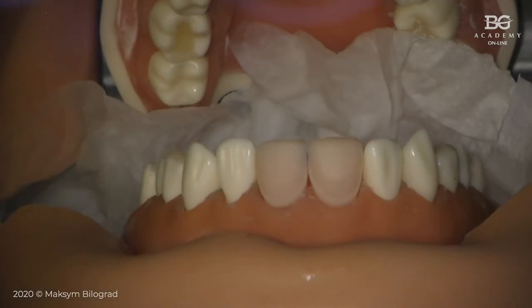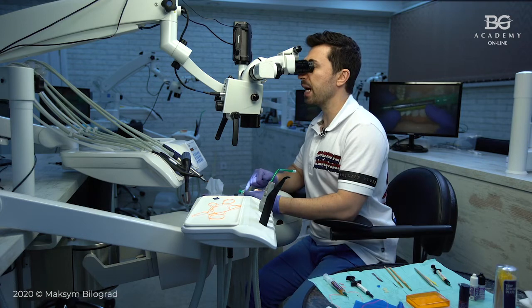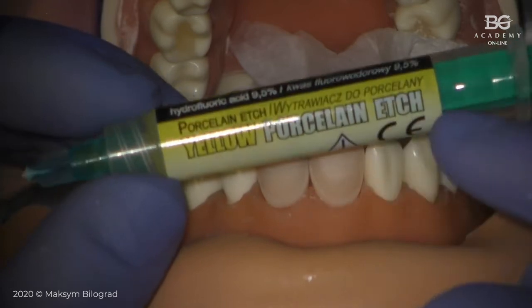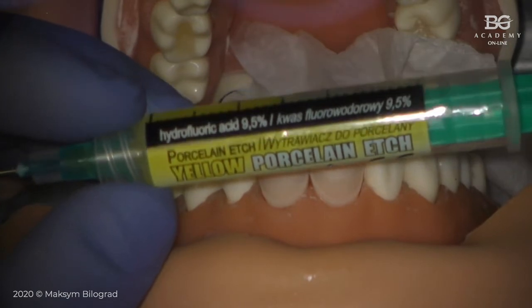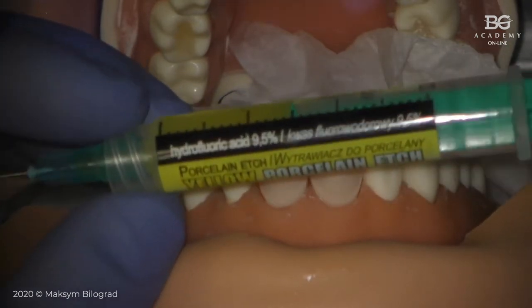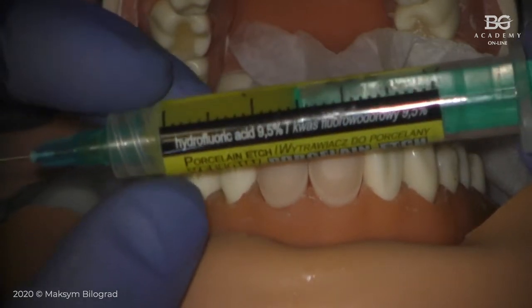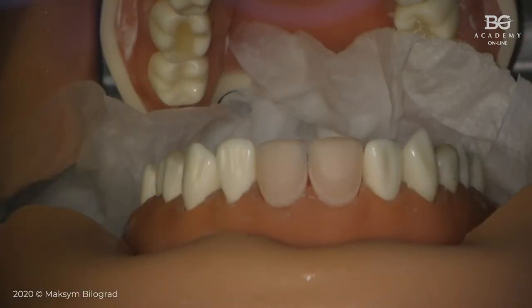If you have to etch, let's say, feldspathic ceramics or lithium disilicate ceramic, we can use 9.5% hydrofluoric acid. It can be Porcelain Etch from Cermamed, this is a Polish product, or it can be from Bisco or from Ultradent. There are many similar products that you can find, but you have to be aware of mixing them. So 9.5% hydrofluoric acid will be used for feldspathic veneers or for lithium silicate ceramic, okay?